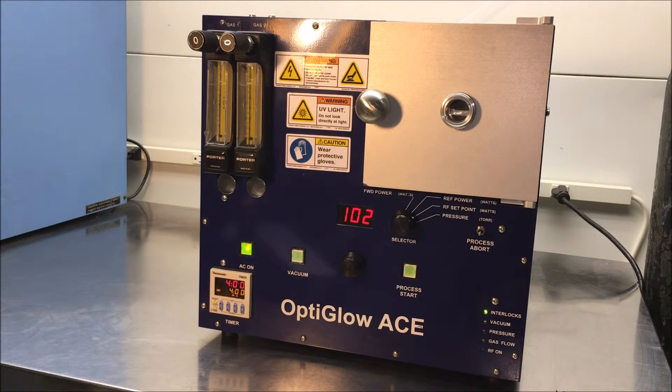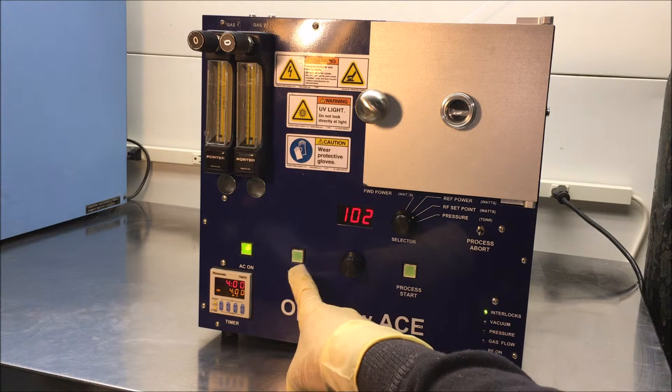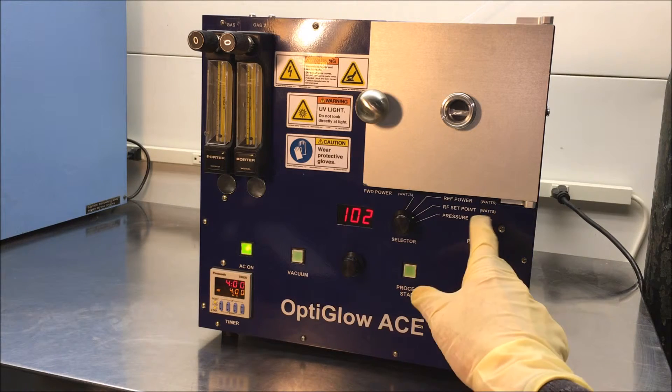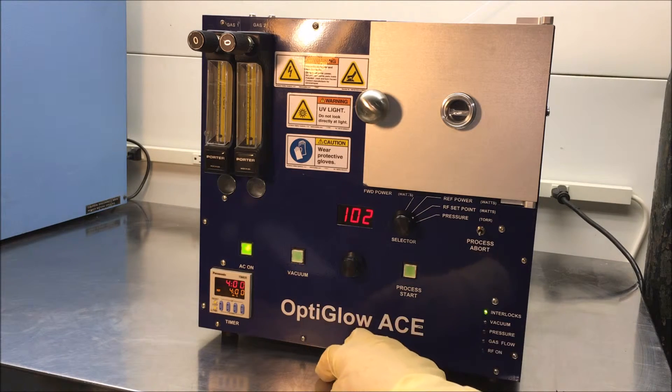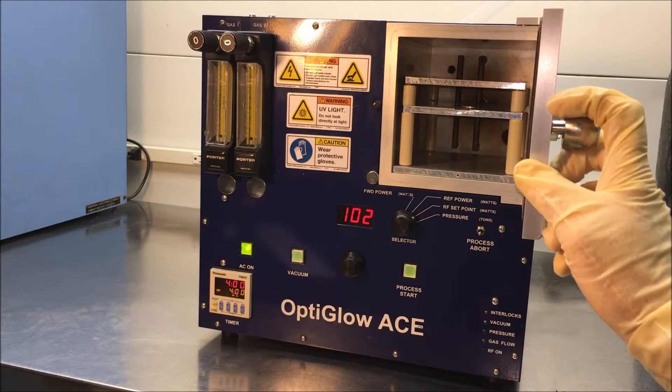The system will vent back to atmosphere after you press the vacuum or stop the process and press the vacuum. Once you're able to open the door, you can retrieve your samples.